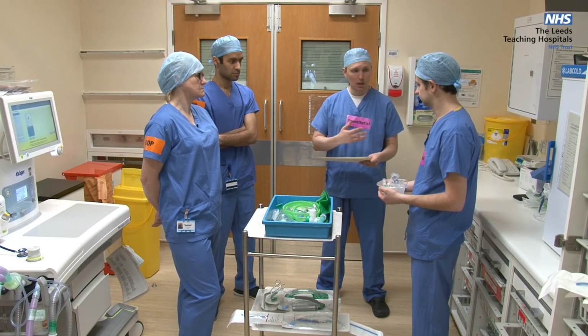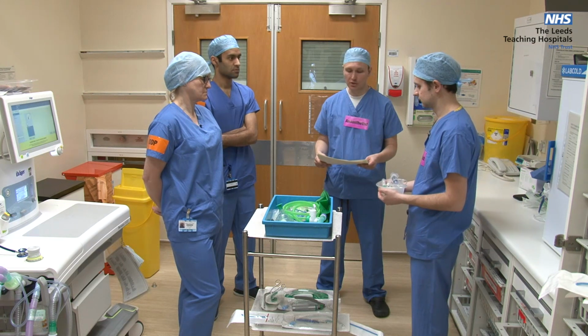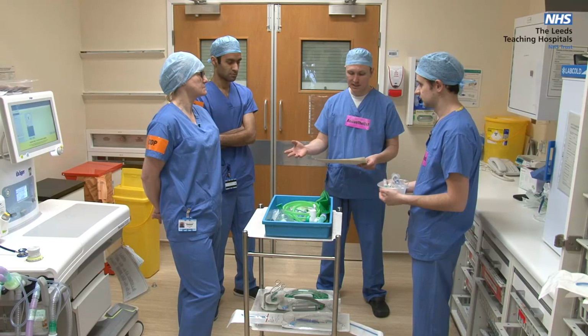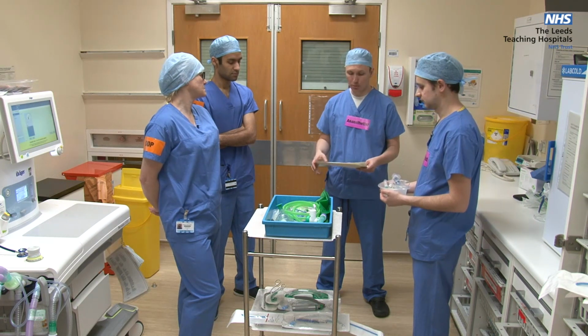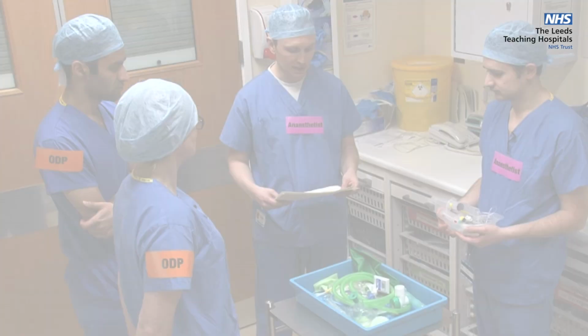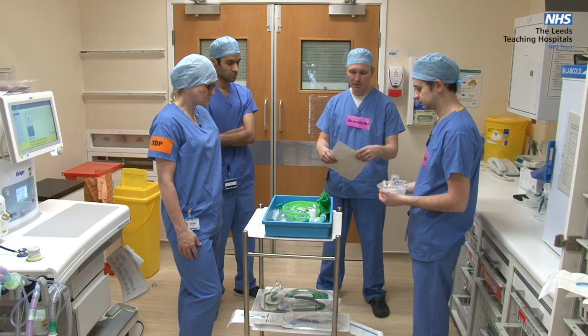My name's Rich. Paul is going to be the first assistant. He's responsible for drugs and the anaesthetic circuit. Dawn, you're going to be the airway assistant, assistant 2, and Harshal, you're the external assistant, so you're going to stay in the ante room and pass equipment if required. Sounds good. If we require emergency help, then we're going to dial 2222 and we're going to declare an anaesthetic emergency. We're going to check the intubation drug box now, so we're going to use that checklist.